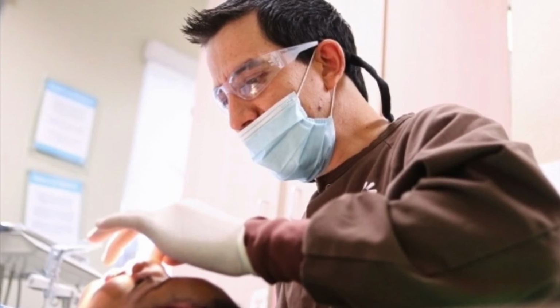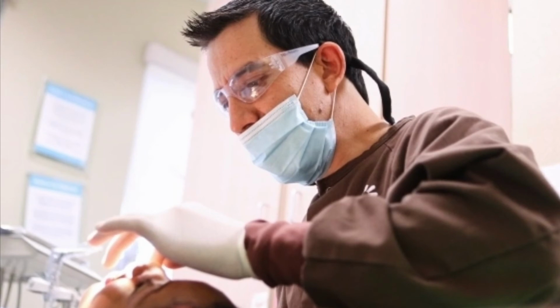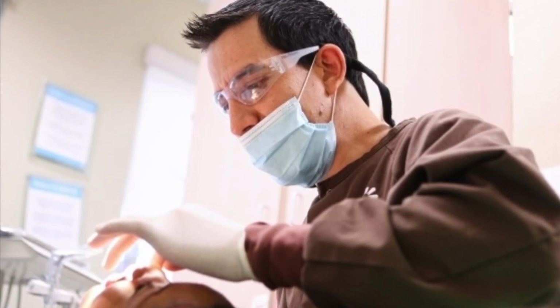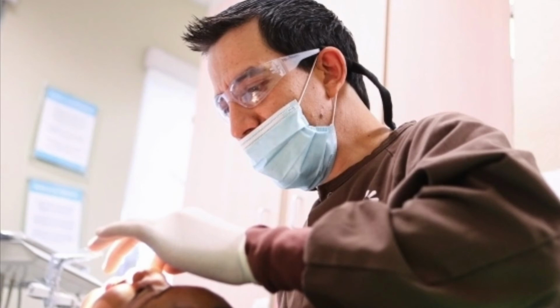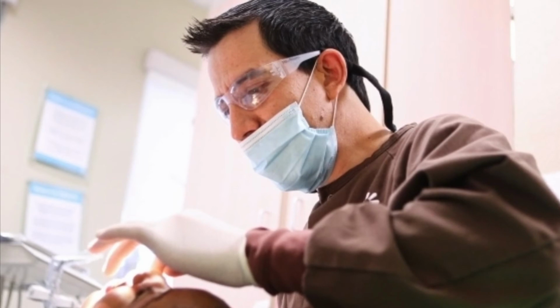In endodontics, we have to know that there are many intracanal instruments. What are these intracanal instruments? These instruments are used inside the root canal. Classification of intracanal instruments: they are divided into 6 groups.